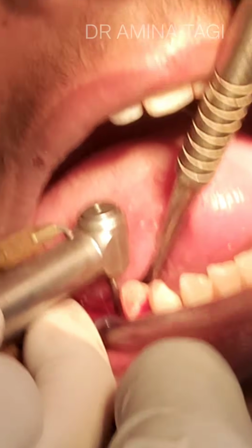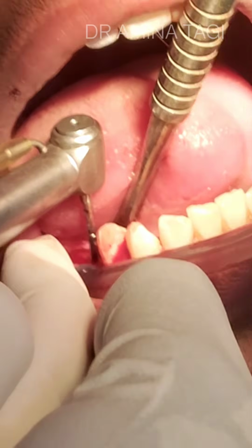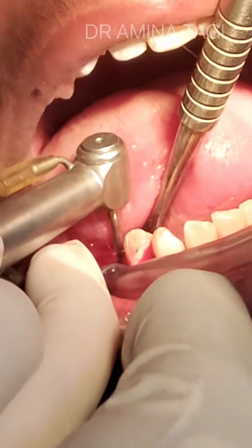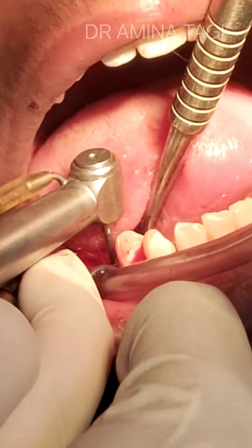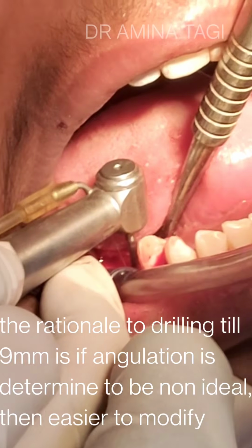Whatever drills will be placed will just follow the pathway of this drill. So now we will insert this drill in the ditch that we have made with the marking drill. Drill it till a maximum depth of 9 mm.